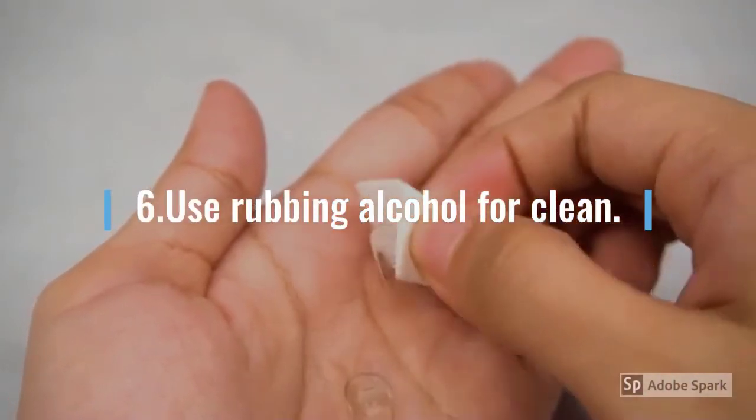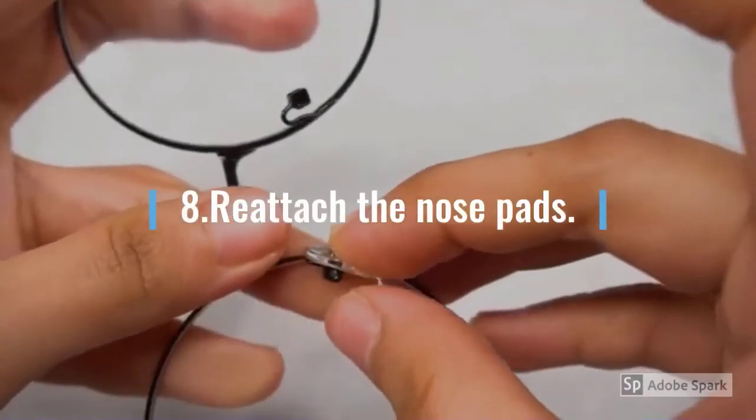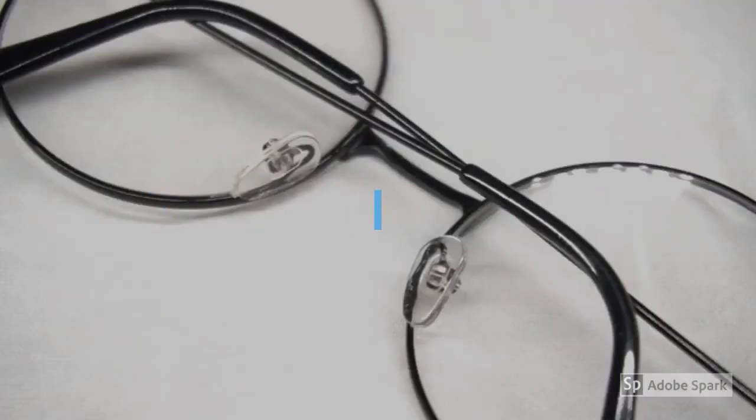Use rubbing alcohol to clean and dry the nose pads, then reattach the nose pads to your glasses.